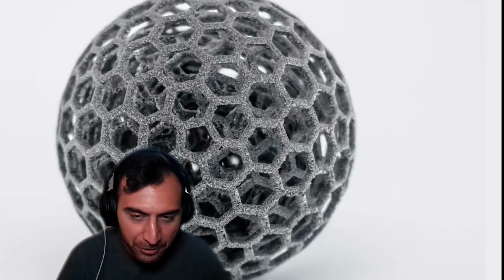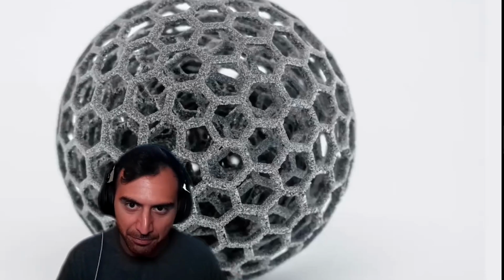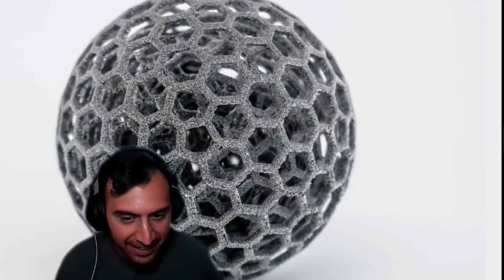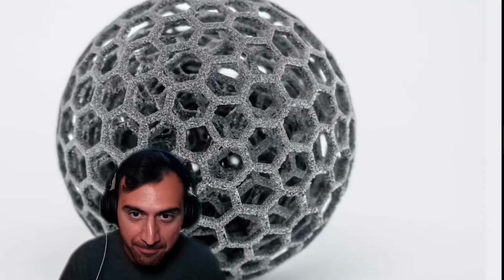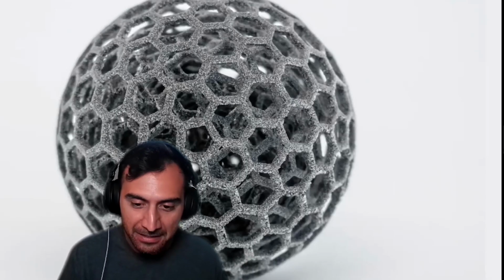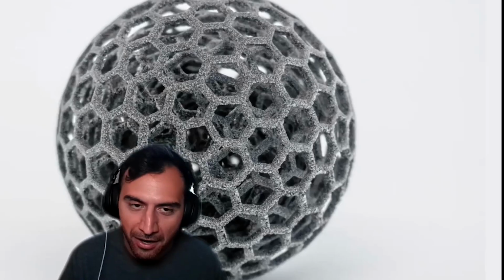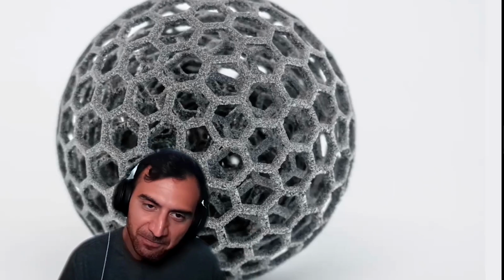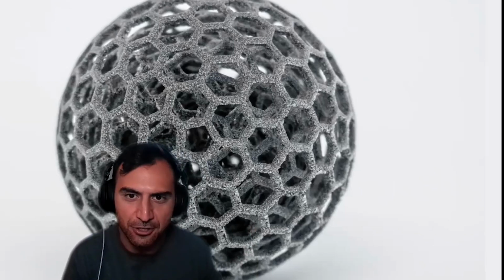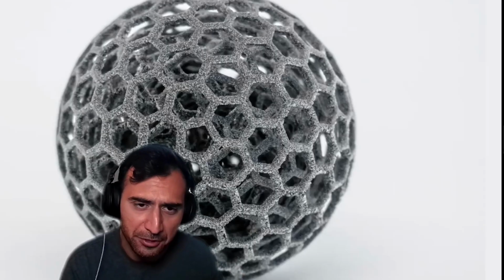So that gave me a potential entryway to be able to do 3D printing. And the 3D printing that I am talking about is additive 3D printing. You got to understand, we've had 3D printing in dentistry for a very long time. CAD/CAM dentistry, milling machines are 3D. Pouring a model is a form of it, and we've been doing lost wax forever. The ancient Romans were doing lost wax techniques, and that's essentially a form of 3D printing.